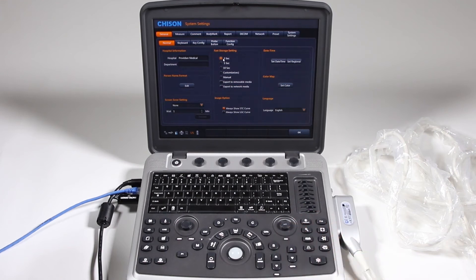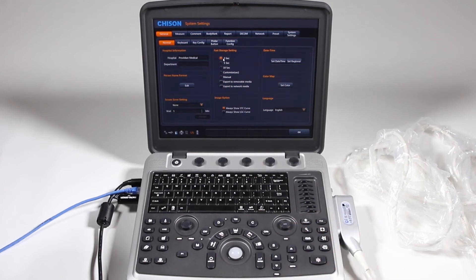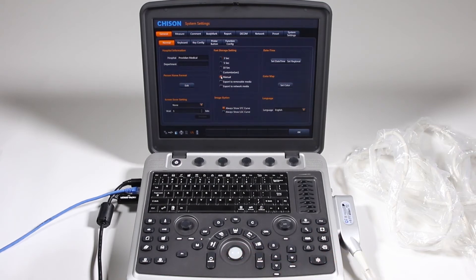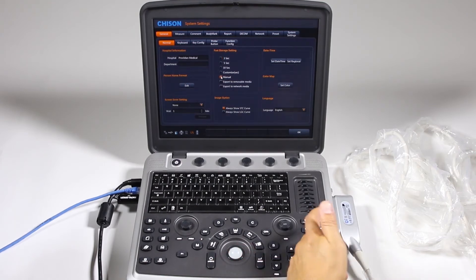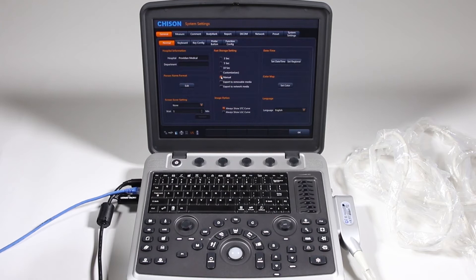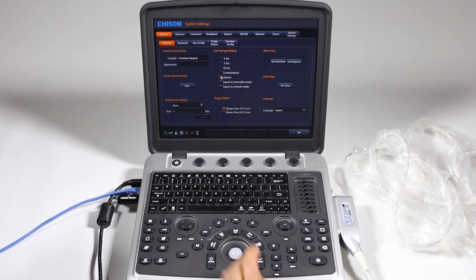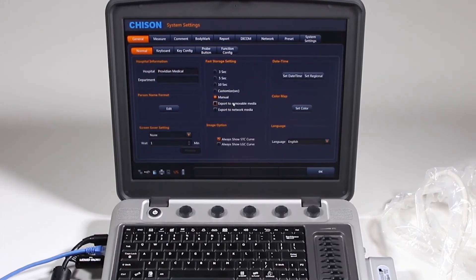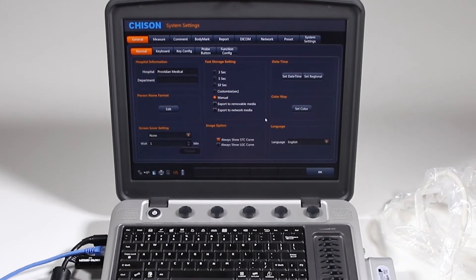Scan, hit this, it'll save for three seconds, hit it, save it for three seconds, or you can choose a manual, or you can click it, let it go, and then click it again when you want it to stop. Now it will only go for a certain amount of time before it runs out of memory, so you can also have it automatically export to removable or network.